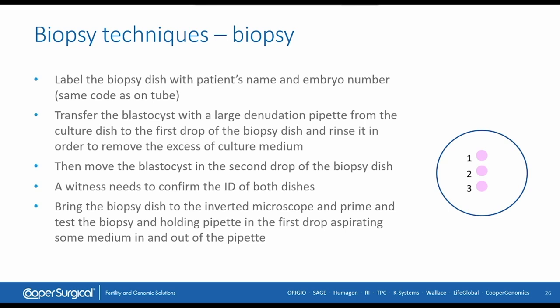To start the biopsy, we label the biopsy dish with the patient's name and embryo number — the same code used on your sheets and on the tube where the cells will be placed. We take the blastocyst with a large handling pipette and bring it into the first drop in our dish for washing, to avoid diluting the HEPES/MOPS buffered medium. Then we bring it into drop number two — a witness must confirm we are placing embryo number one into dish number one. We then prime our biopsy and handling pipettes in drop one and test the injection/aspiration system.